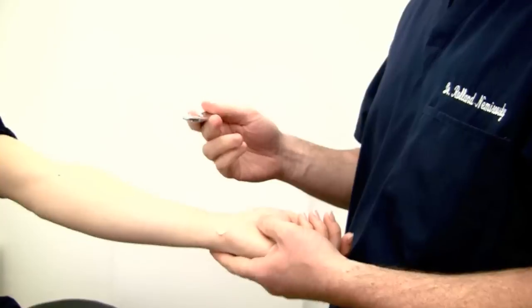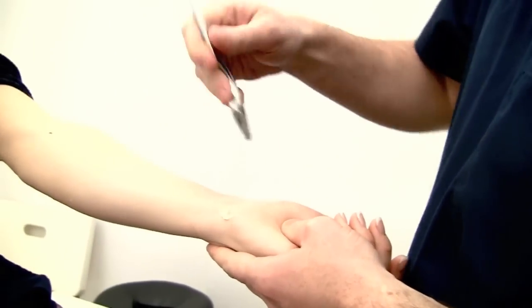Electric stim helps with conditioning the muscle. Typically what you want to do is get the muscle to fatigue. Fatiguing the muscle, it relaxes, and therefore you're going to relieve some of the stressors, specifically if the muscle is in spasm. So here I'm using Graston Tool 6.